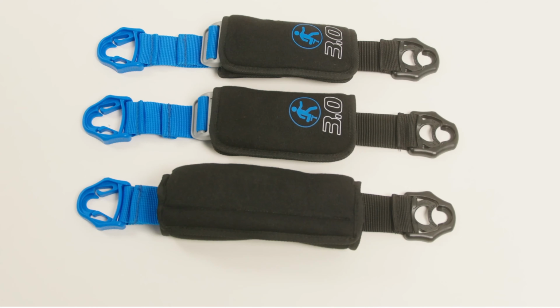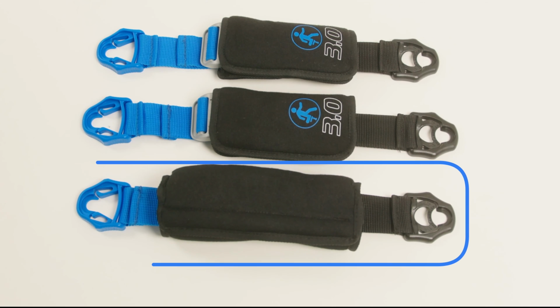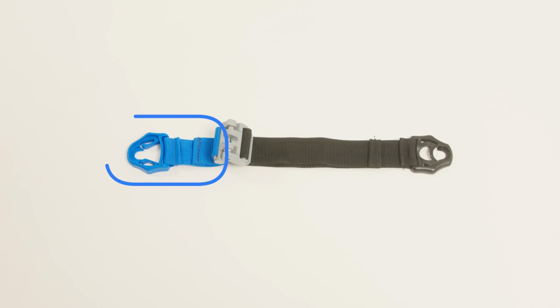Straps. The strap system on the iWALK crutch is simple, but often used incorrectly, so please follow along carefully. All three straps are the same, except that the strap that goes behind the knee has a larger pad. The strap consists of two sides. One side has black webbing. The other has blue webbing. Although the two sections function similarly, they have very different purposes.